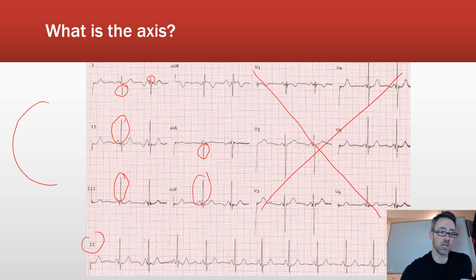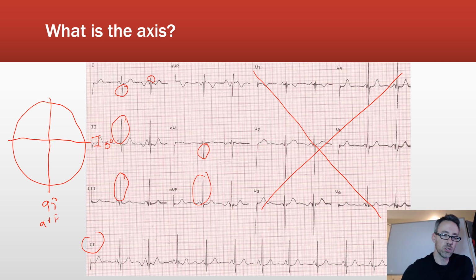So for example, here I'm going to draw out just a couple of degrees there. I know it's not exactly precise here, but if this is 1 over here at 0 degrees, this is 90 degrees. Here, this would be our AVF. Okay, and then 2 is over here somewhere, at 60, and 3 is over here. So our mean electrical axis is somewhere between 2, AVF and 3.